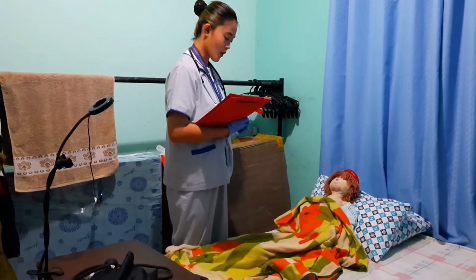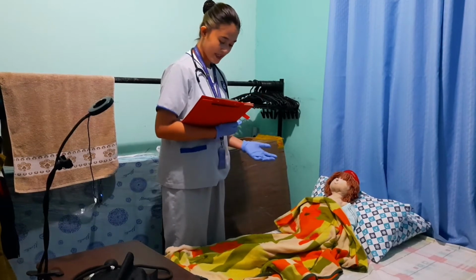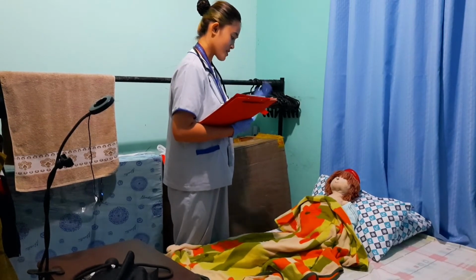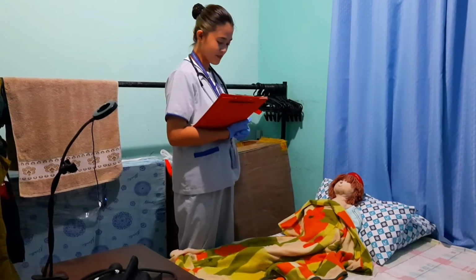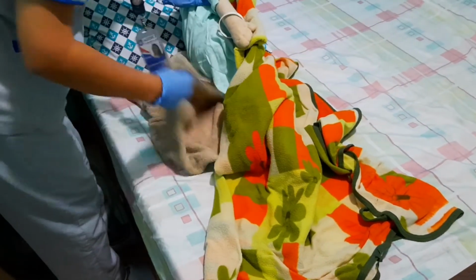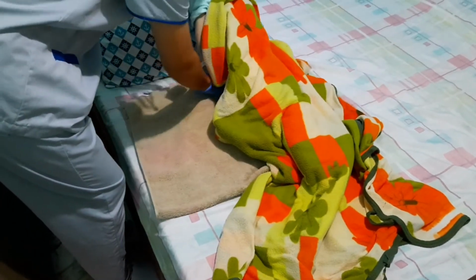And I'm going to put also an underpad and do a diamond drape for you, for me to have an easier way on performing this Perilight procedure now, okay? And once we assist the patient in dorsal recumbent position, we must put the underpad underneath her buttocks and perform diamond draping to the client, exposing the perineum.